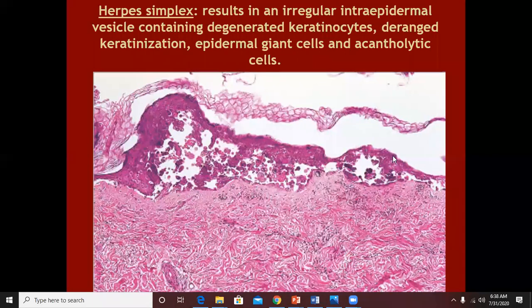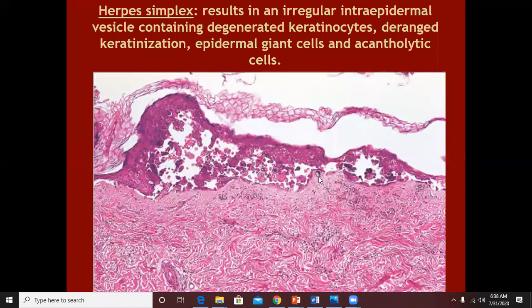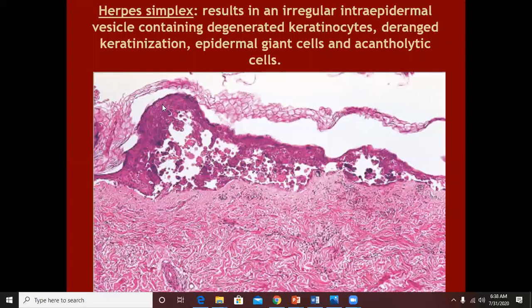In this viral vesicle, you can see that it is completely involving the epidermis — there is only the dermis visible. The virus is typically involving the whole epidermis. In addition to the balloon degeneration, acantholysis, intracellular edema, and disintegration, another typical feature of herpes virus is the presence of typical giant cells.